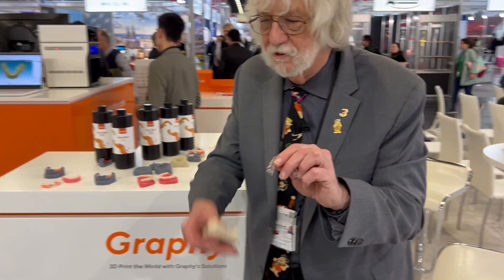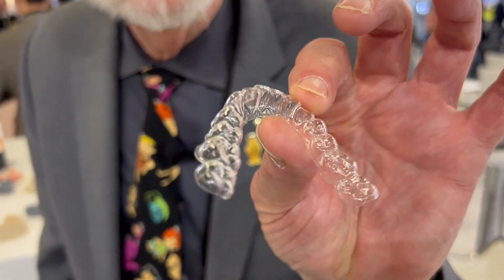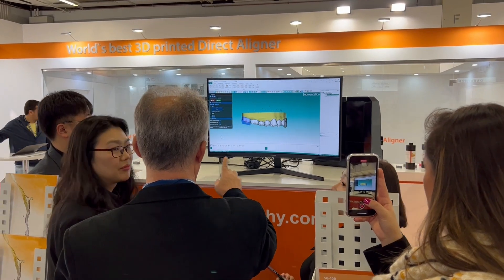Now, the Graphi company says throw away the model — we'll print the aligner directly. And it's flexible, it works the same way as the other aligners do, and it's going to change the whole landscape of aligners.